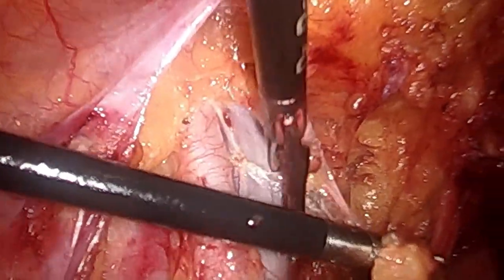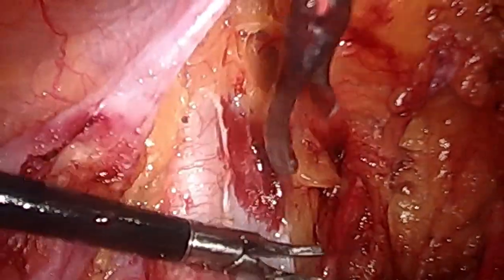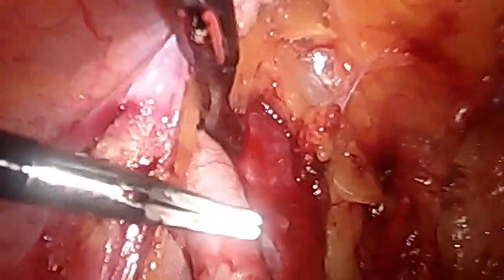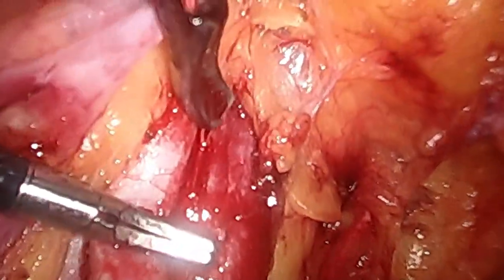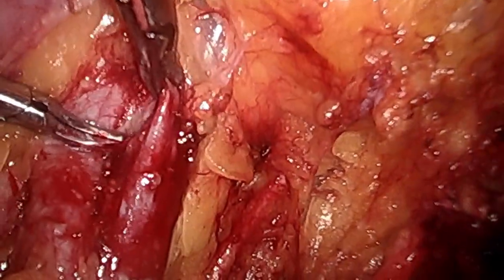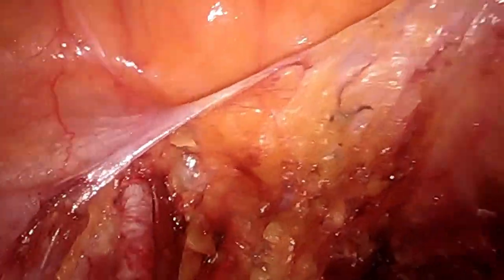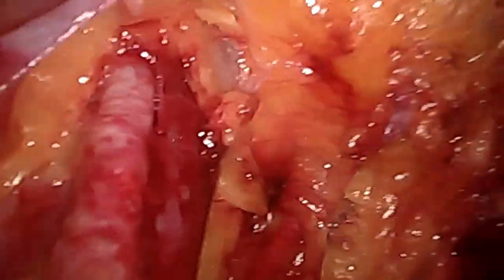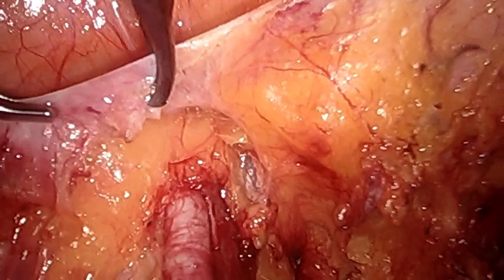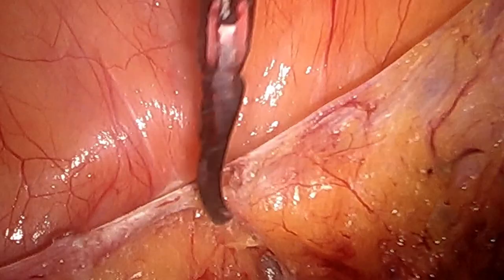You can notice the small nick over the external iliac vein that occurred during dissection of these lymph nodes. Obviously when you are doing such surgeries you take care and stay most vigilant not to injure, but these kinds of injuries are possible and it is very important for all of us to know how to deal with them. The first reaction can obviously be panic, but it is very important for the operating surgeon to be calm and composed when you have such an injury.